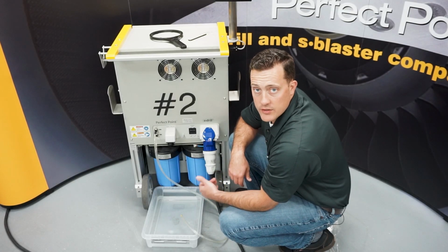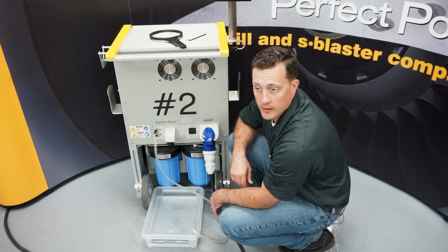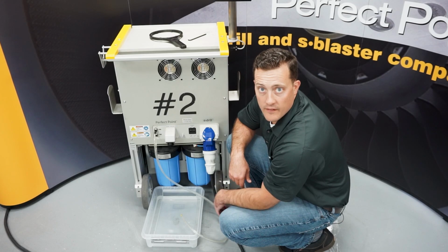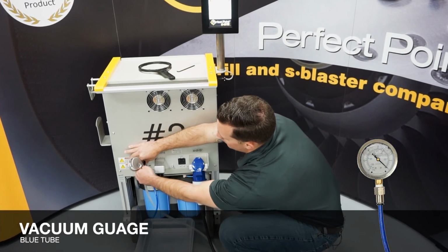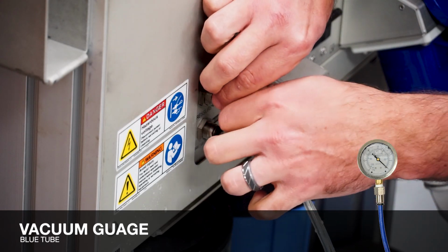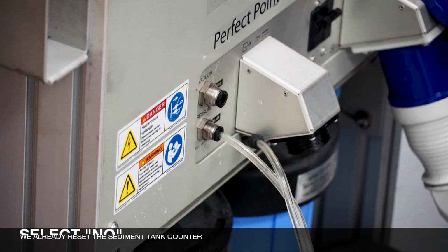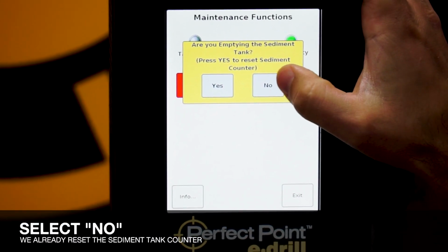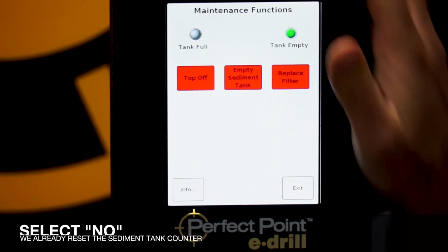After that first fill, now's a really good time to check our vacuum on the system, make sure we're hitting the numbers we should be hitting. So to do that, we're gonna need our vacuum gauge. Remove the vacuum portion of the servicing tube by pushing in and pulling out. Up here it says, are we emptying the sediment canister? We're gonna say no, because we just emptied it and we cleaned it and we said yes a second ago.